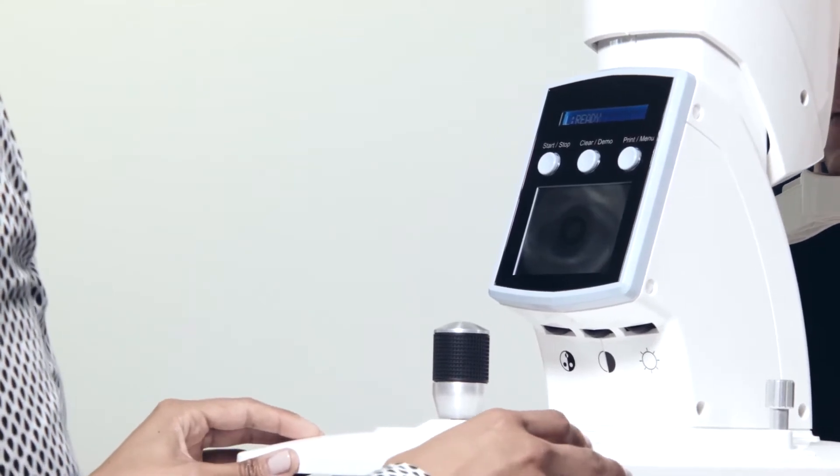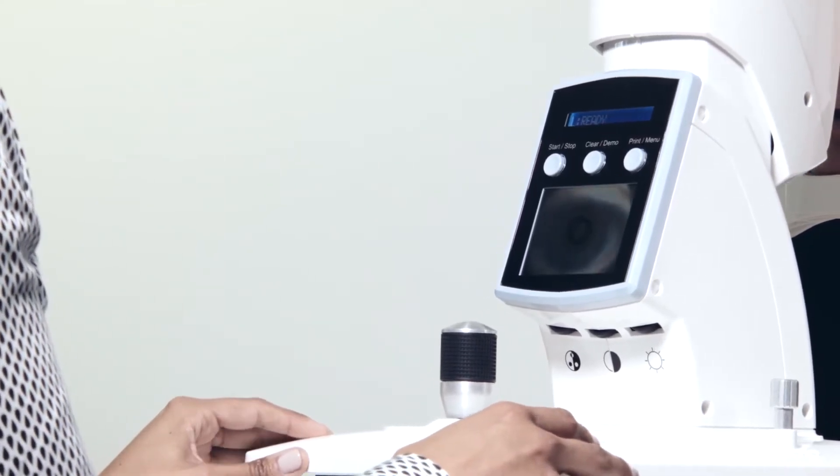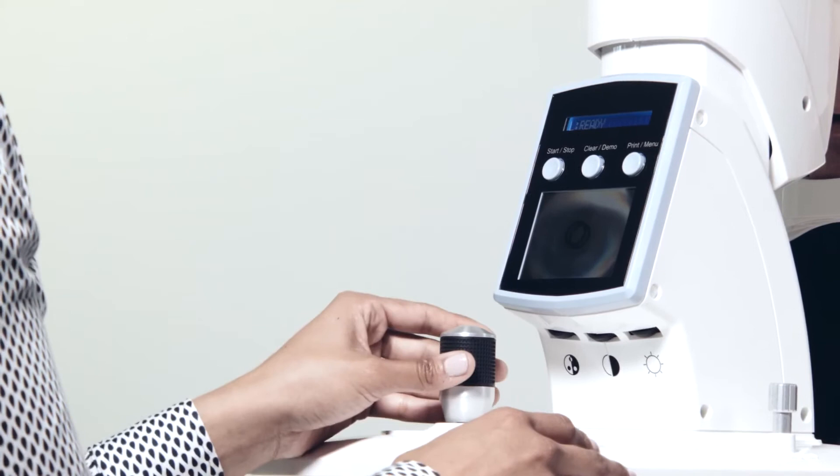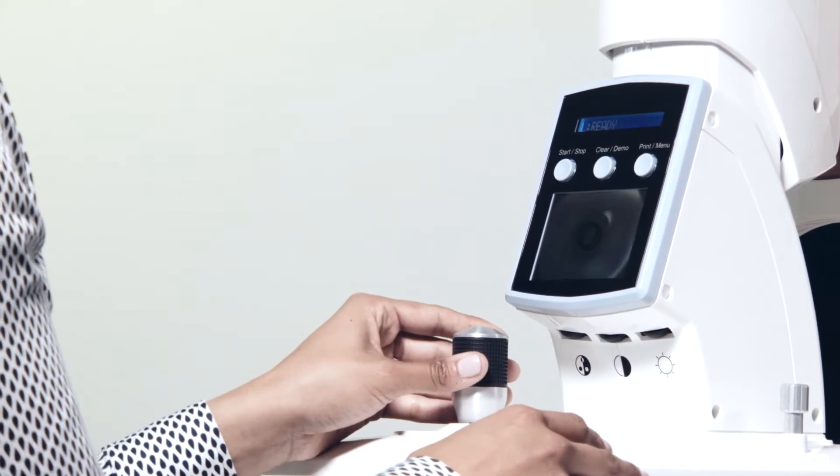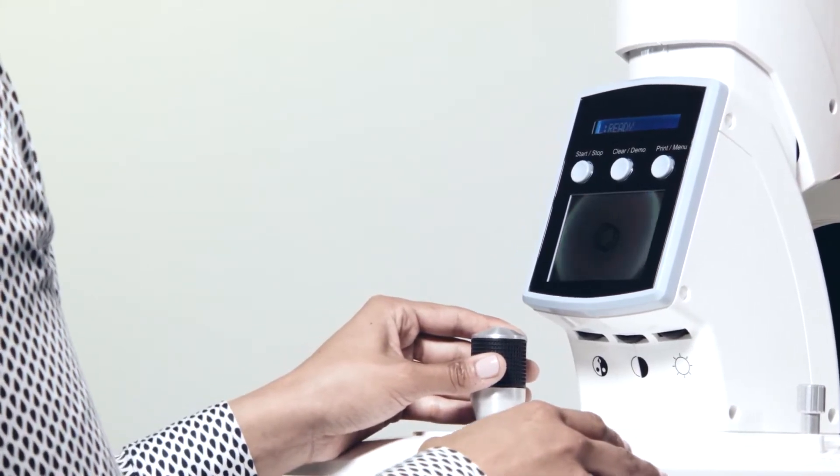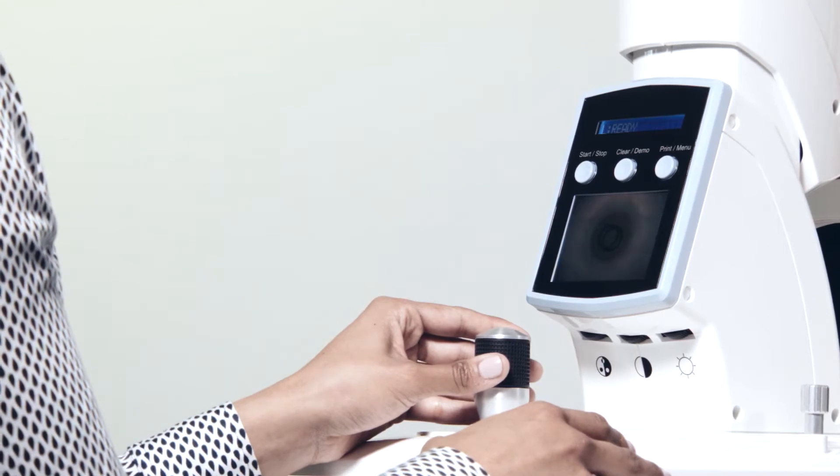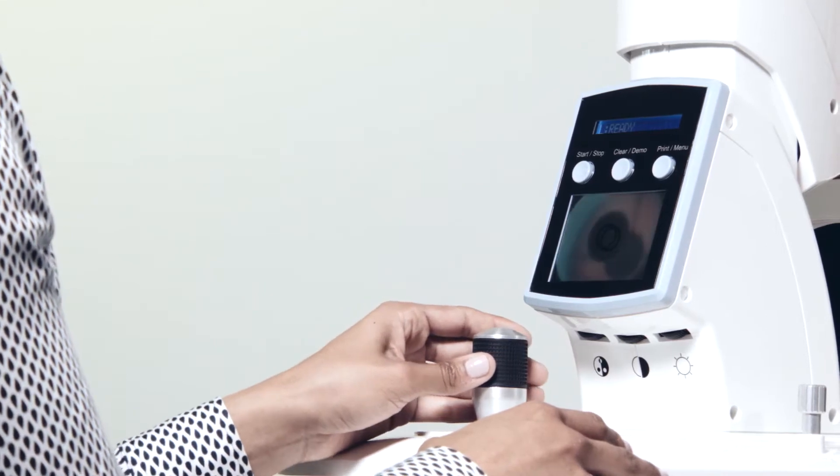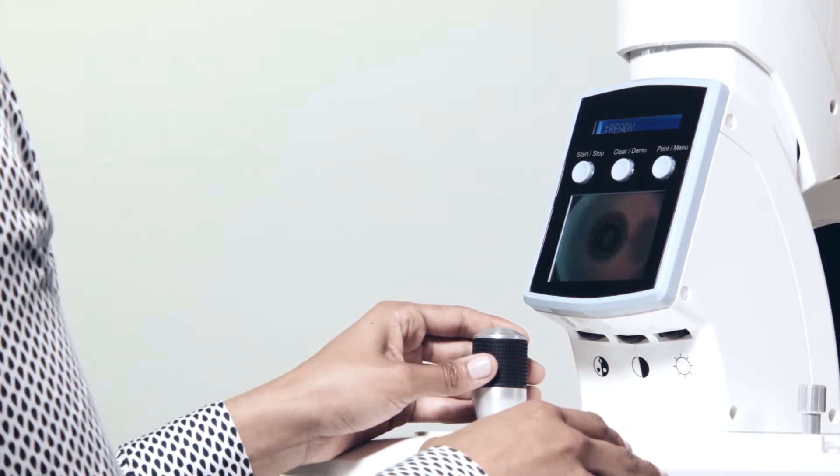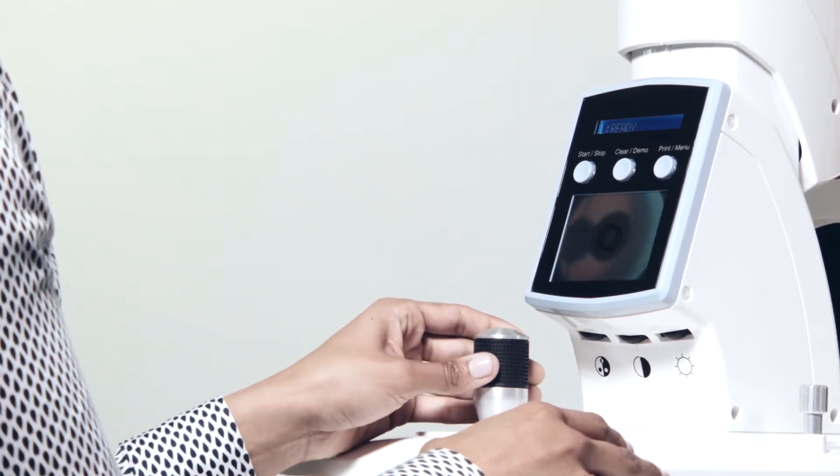Hold the joystick with one hand and move the PulseAir until the eye is central on the alignment video screen. Move the tonometer toward the patient until the eye is in the crosshairs. The tonometer will fire automatically.